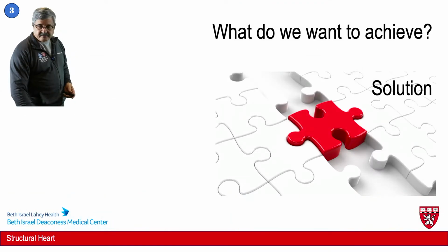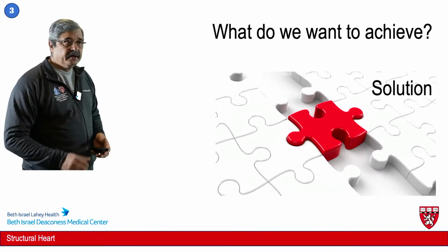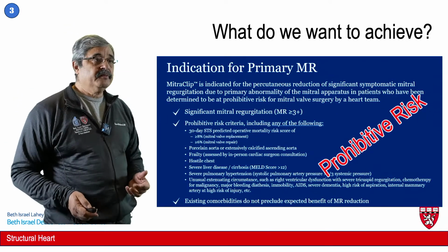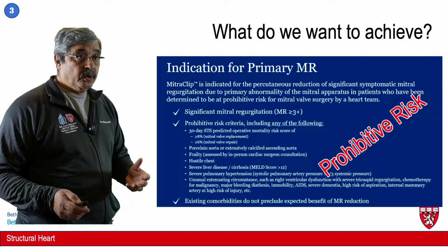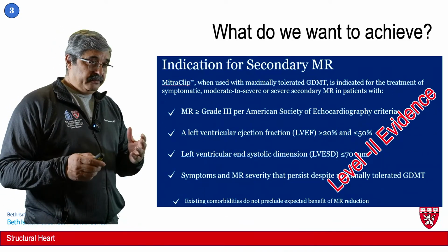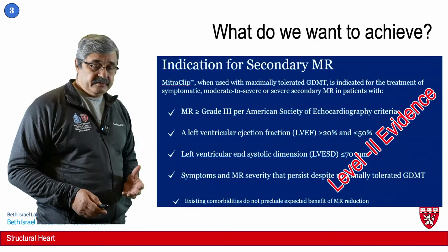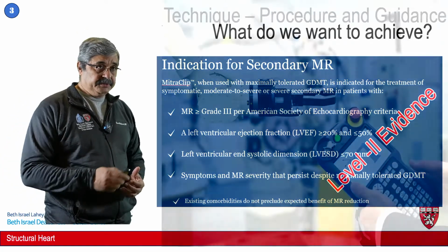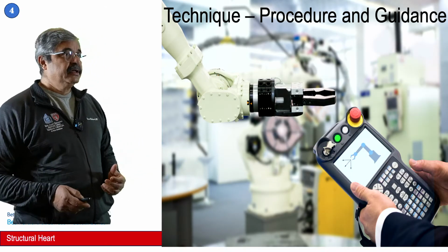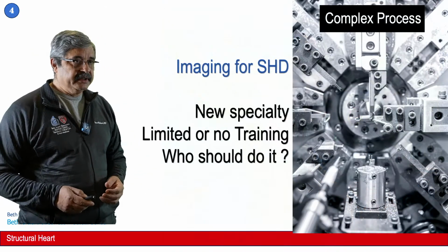So what have we achieved so far? For primary MR, the indication for edge-to-edge repair is only when you are a prohibitive risk for surgery, and for secondary MR, you are an ideal candidate if you have disproportionate mitral regurgitation. Now comes the most important part, and that's the technique and procedural guidance in these patients.